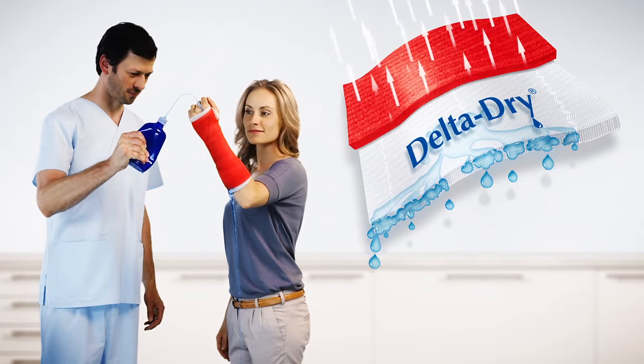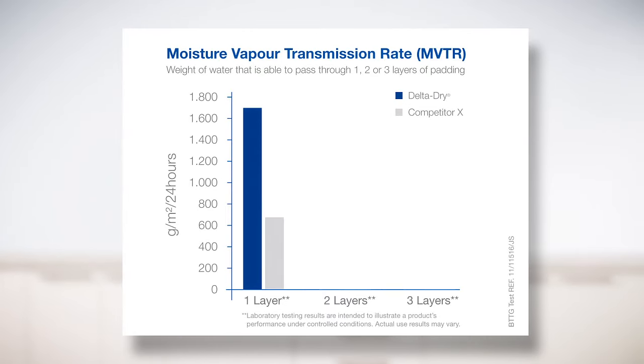Residual moisture evaporates. In this way, cast and skin dry quickly. Laboratory tests prove that with the same amount of layers, Delta Dry allows twice as much moisture vapour to evaporate through the airy mesh as conventional products.